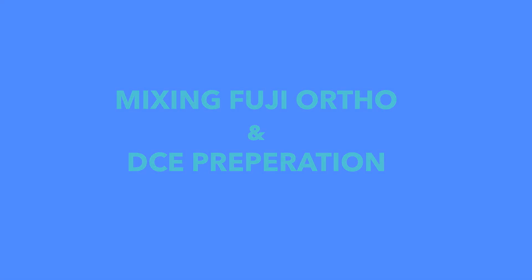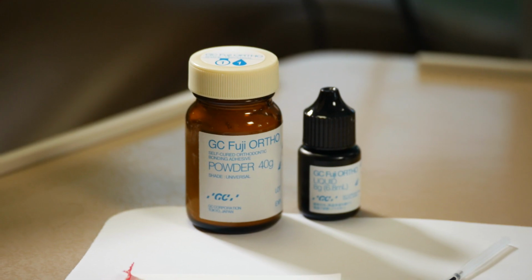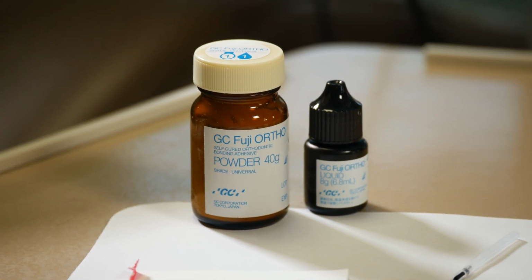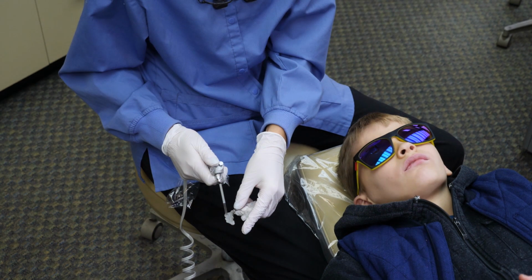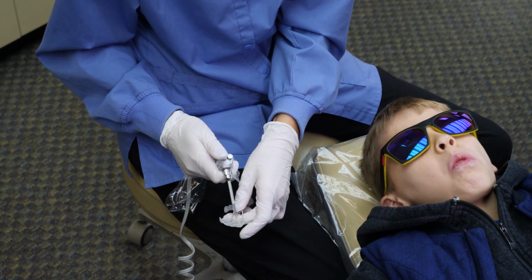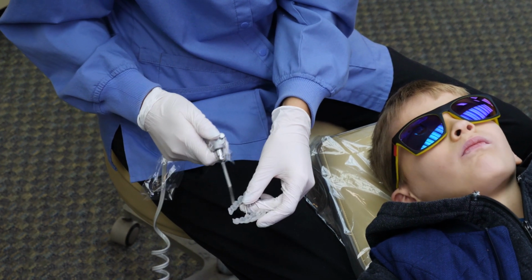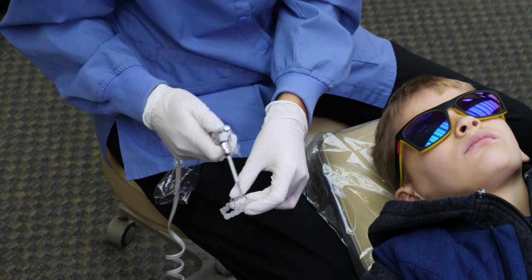Prior to mixing this Fuji modified glass ionomer cement, the assistant must rinse and dry the inside of the DeLuke contoured expander. A light spray of air and water followed by a steady spray of air until the inside of the expander has a definite etched and dry appearance.